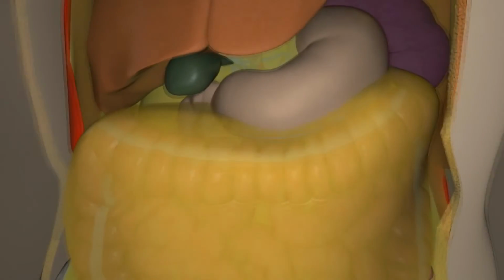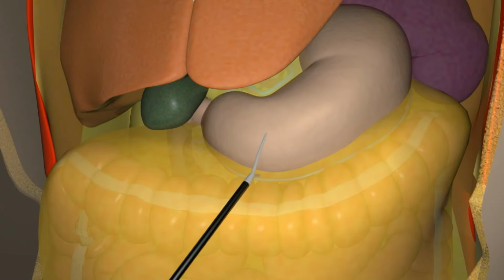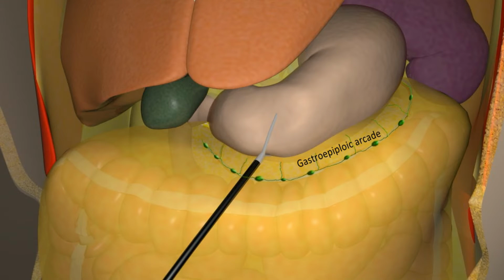In order to remove all the potential lymph node involvement and the metastatic deposits around the gastroepiploic vessels and the greater omentum, the greater curvature of the stomach was skeletonized. Therefore, the greater omentum together with the gastroepiploic vessels was included within the envelope of the specimen of the complete mesocolic excision.